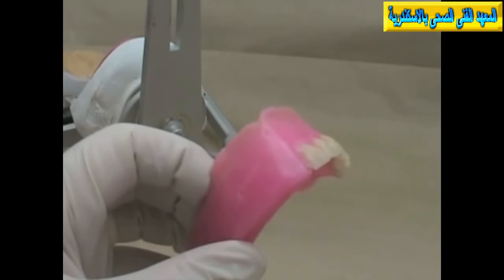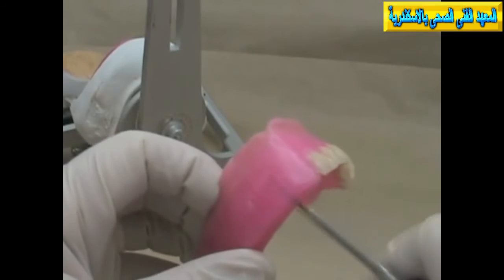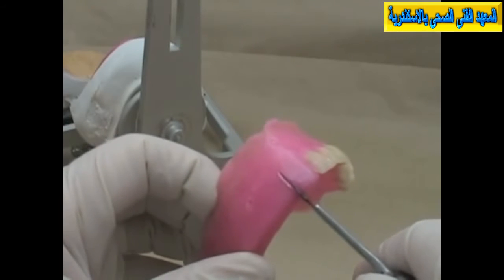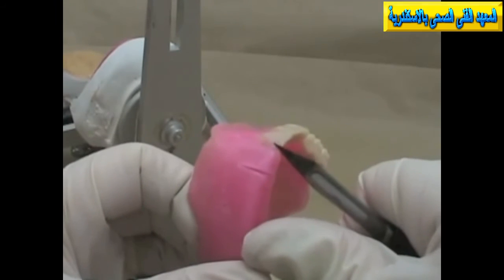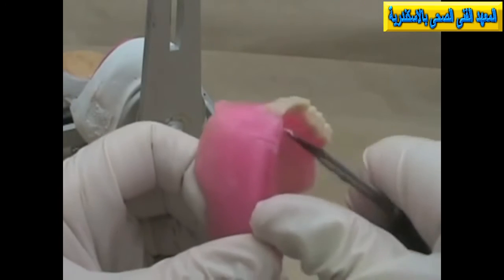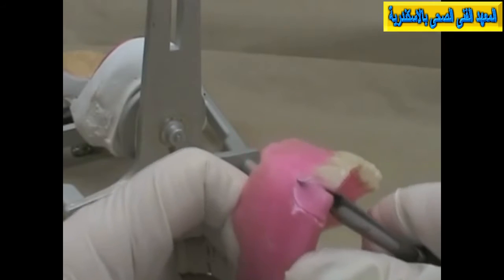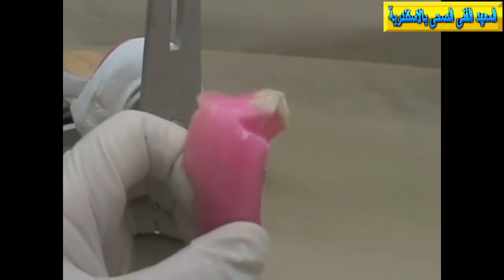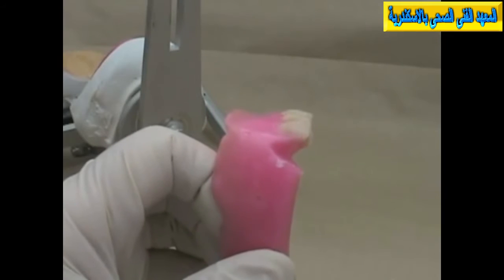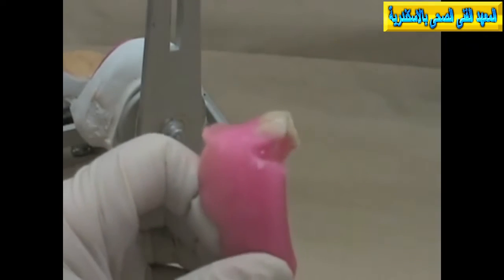If your maxillary rim is contoured properly, it should show you on the facial surface where you want the facial surface of the corresponding tooth to be. When I'm taking out the wax, you can notice I'm using a good finger rest so I don't slip and cut myself. Every year we have a few incidences where people don't use a finger rest when they're using a knife or a sharp instrument, and they cut themselves. You don't want to be doing that.